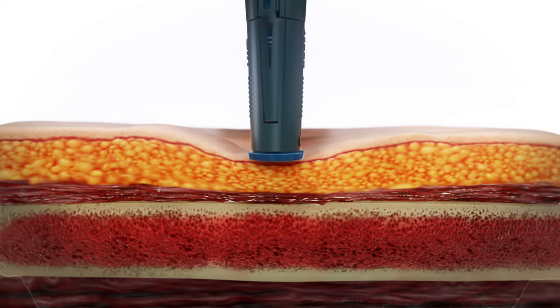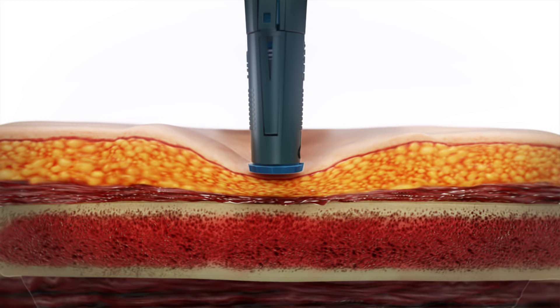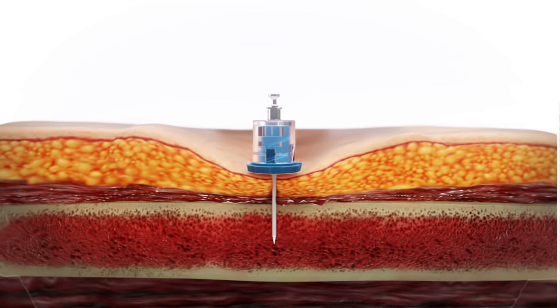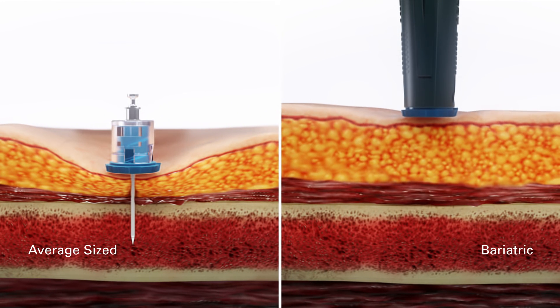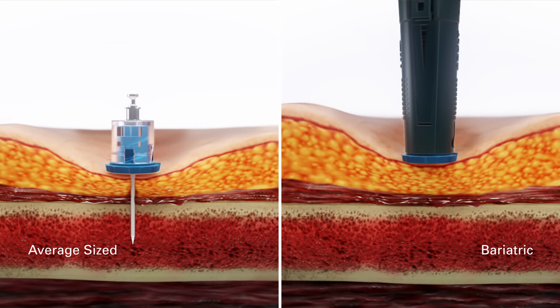The pressure applied causes localized compression at the insertion site, shortening the distance the needle needs to travel. With this design, the Neo adult is able to cover the full adult range — from average size to those in the bariatric range — on both the proximal tibia and humerus.